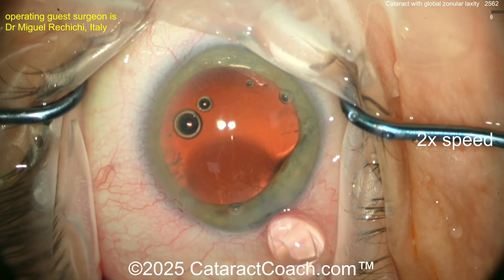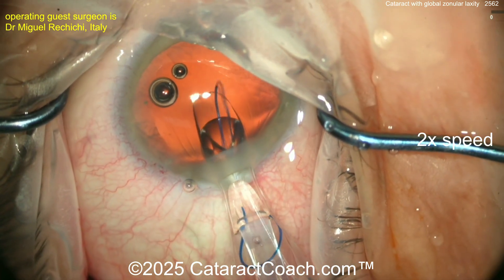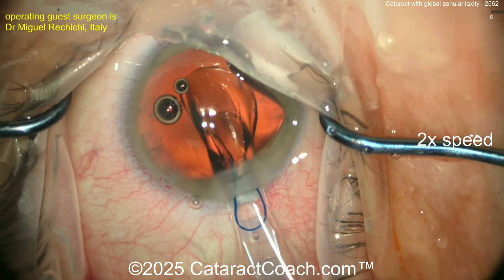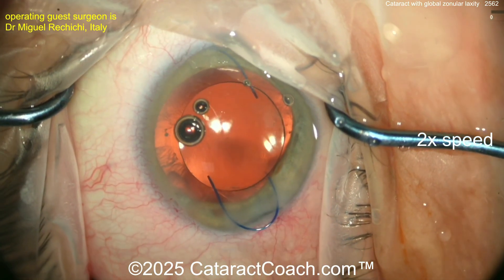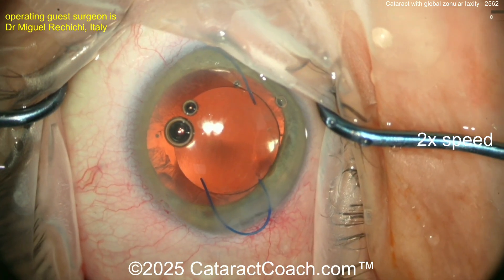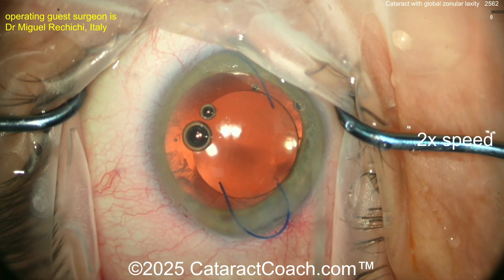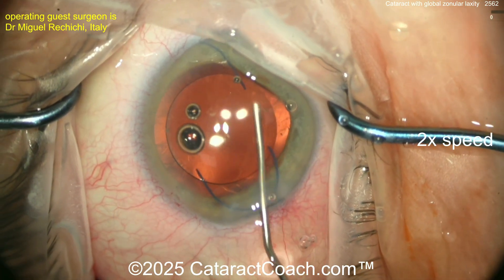With a three-piece lens, what's really helpful with global zonular laxity — David Chang taught me this — is putting the haptics in the sulcus and doing an optic capture. The 7L rule: make sure the leading haptic looks like a number 7, and the trailing haptic like a capital letter L. Get this dialed in, put the haptics in the sulcus, then optic capture — that will give great long-term stability.